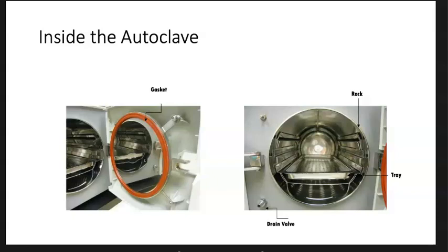We also have to make sure that when we're loading our autoclave with our surgery packs, that they do not touch the edges of the autoclave. The edges of the autoclave within the barrel get very, very hot, and you could risk burning your surgery packs.